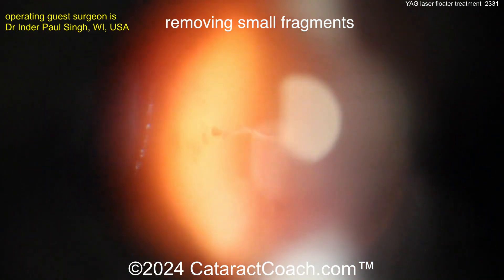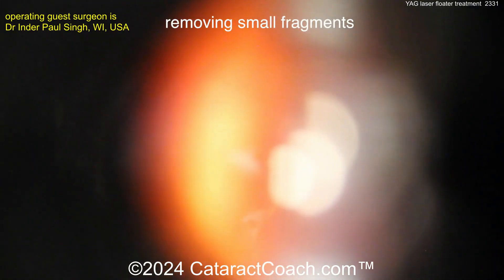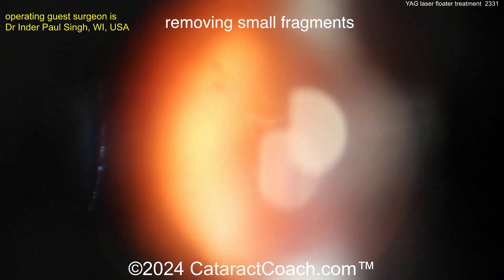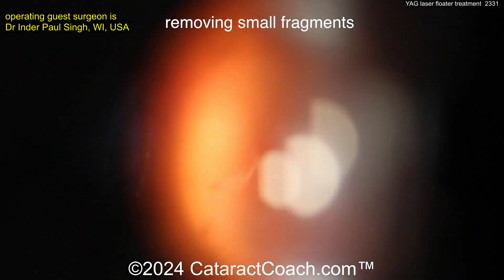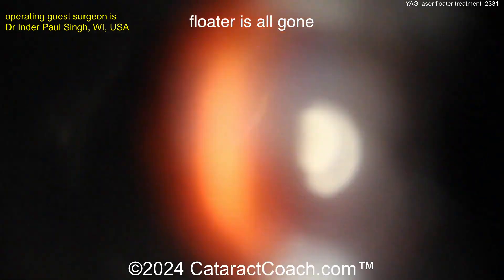This is also due to the improved efficiency of this laser using a narrow Gaussian four-nanosecond pulse. Here we are with less than two minutes in, and most of the floater has been dissolved — just a few small remnants remaining. The patient is almost done and very happy.